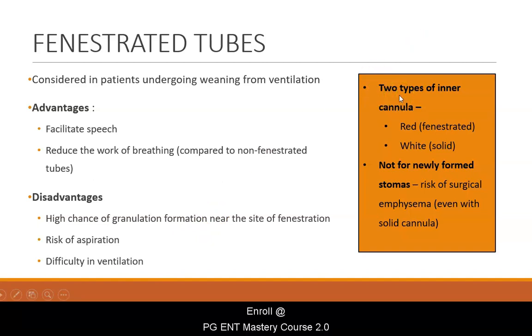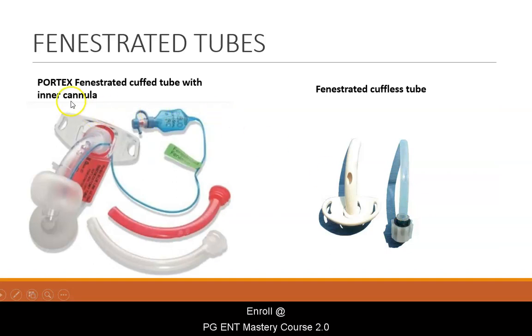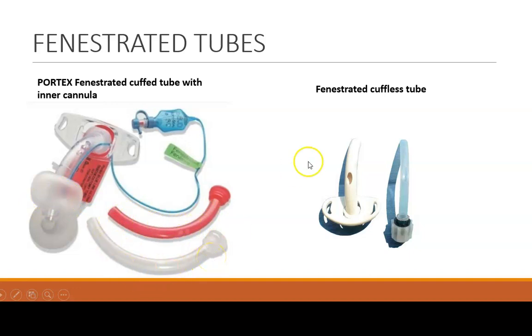With a fenestrated tube, especially the one provided by Portex company, there are two types of inner cannula: a red fenestrated inner cannula and a white solid inner cannula. You must always remember that fenestrated tracheostomy tubes are not for newly formed stomas, because even with a solid cannula there is a risk of surgical emphysema. Here you can see a Portex fenestrated cuffed tube with inner cannula showing the fenestrations, the cuff, the red fenestrated inner cannula, and the white solid inner cannula. On the right side is a fenestrated cuffless tube, which has a fenestra in the tube and inner cannula but no cuff.